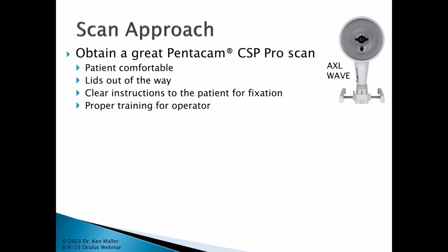You would be the best one to assess that, and although you can teach a tech certainly to be able to assess whether the scan is acceptable or not, no one's going to be better at it than you. So that is something that may save you grief down the road if you are taking your own scans.